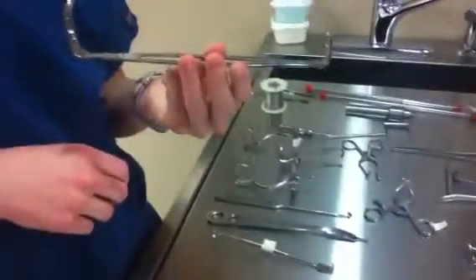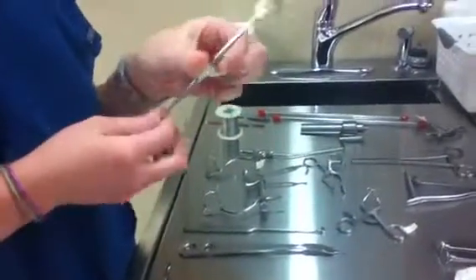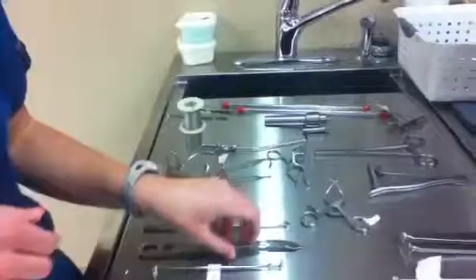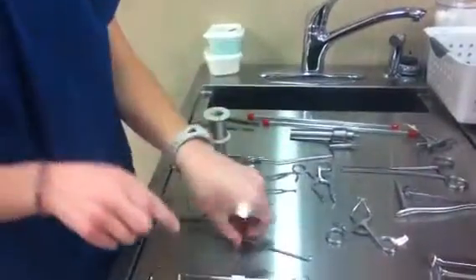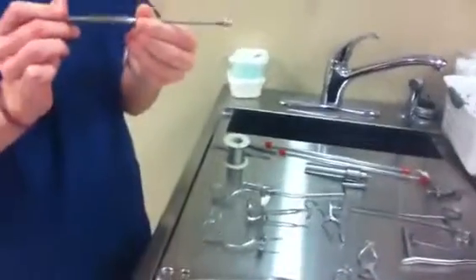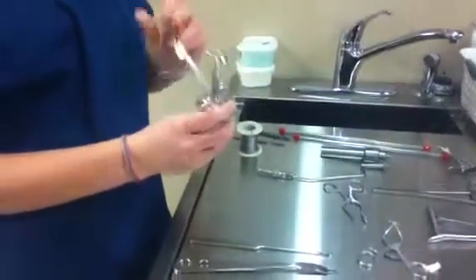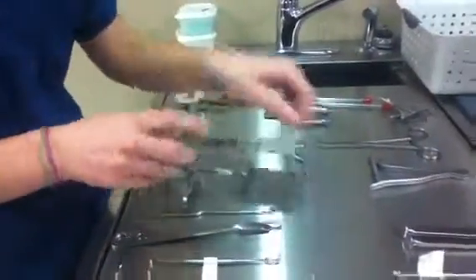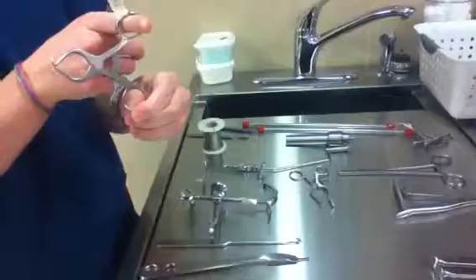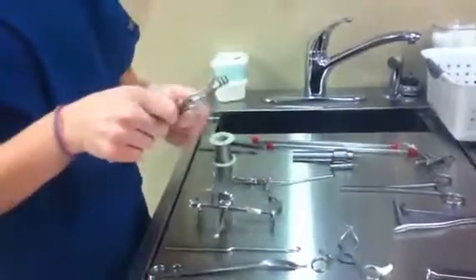This is the Army Navy retractor — a hand-held retractor. And this is the Senn. This is Hohman. The Snook Hook. This is the Balfour Retractor. This one's the Gelpi Retractor. The Weitlaner.